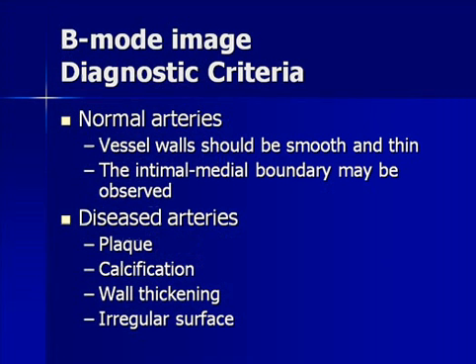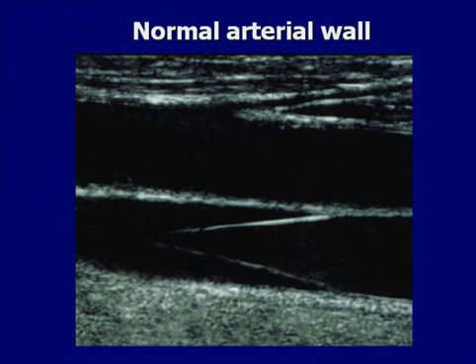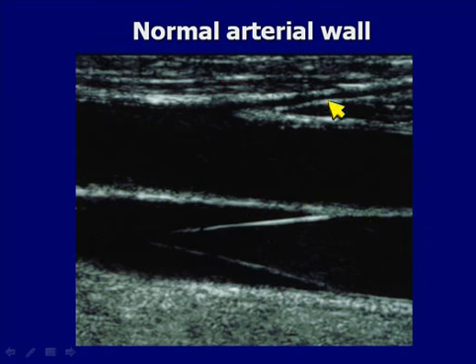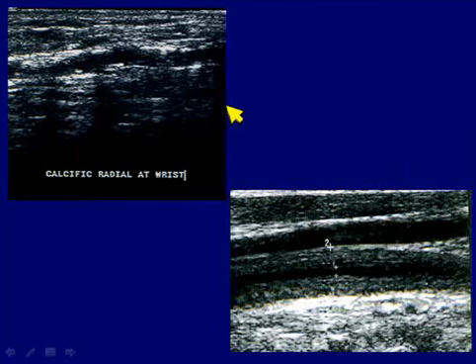An artery is an artery — a normal artery should look nice and thin-walled, be smooth, and have an appreciable intimal-medial boundary. As we get various levels of disease, we'll see plaque and calcification. Here is a nice normal artery with a companion vein underneath, showing nice thin smooth walls with no irregularities and a small collateral side branch, as opposed to these diseased vessels.